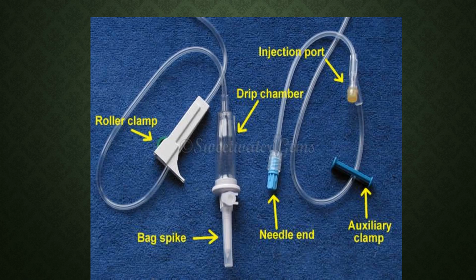Okay, now you have the needle end, and that's an old slide, because we have needleless systems now, so that's not really the needle end, but the end that plugs into your IV. The IV cannula that went to the patient has a little thing on the end that's open, and that just hooks into the actual IV going into the patient. And then you have an injection port up on the top right.